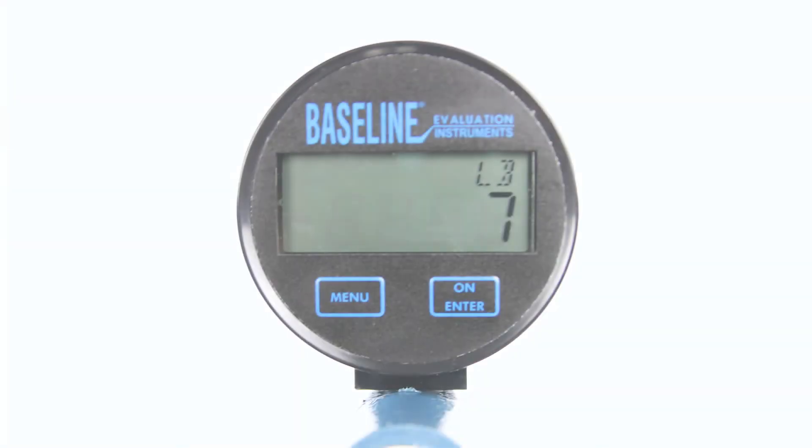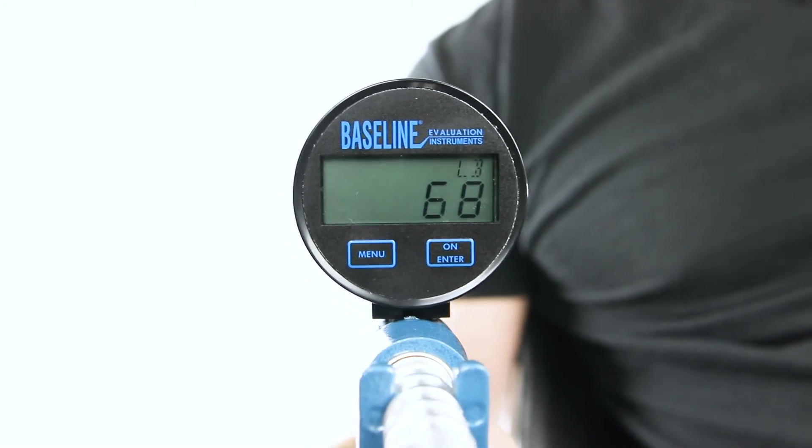The digital model is a hydraulic dynamometer with an easy to read digital display gauge. It has an extended maximum capacity of 300 pounds or 136 kilograms.